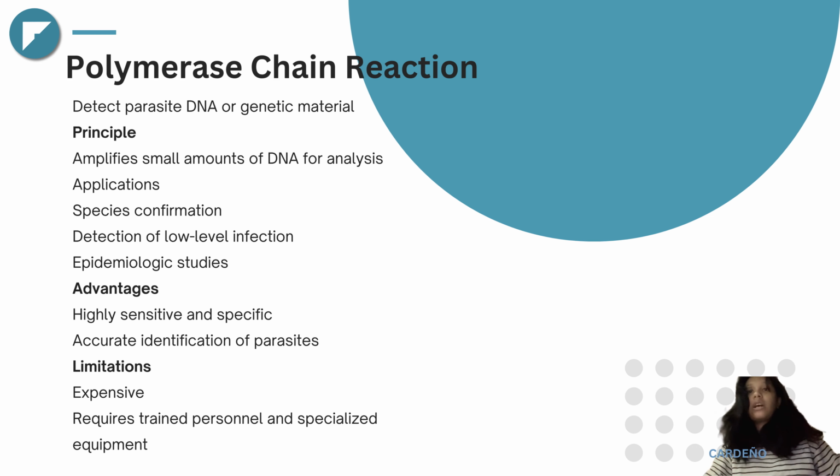The advantages are high sensitivity and specificity, ensuring accurate identification of parasites. However, limitations include expense, the need for trained personnel, and specialized equipment, which restricts its use mainly to advanced laboratories.